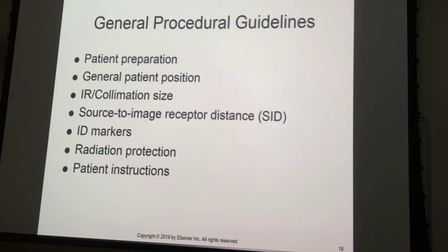What they're going to be looking for, before they even try to zero in on the ribs, is: is the lung still inflated? Does the patient have subcutaneous emphysema? Y'all seen that? Subcutaneous emphysema is where not only do you have a pneumothorax, but some of that air in a lot of cases leaks out into the tissues, and you can actually see the striations in the patient's muscles.